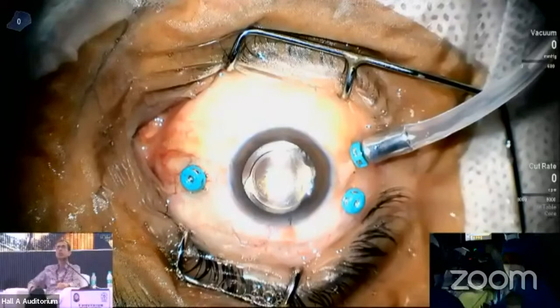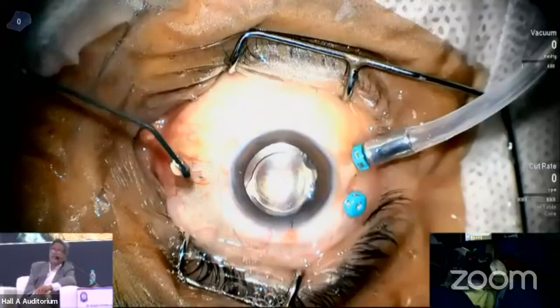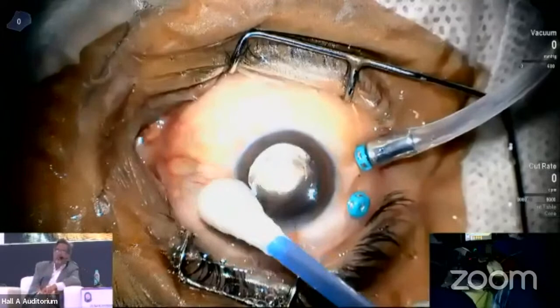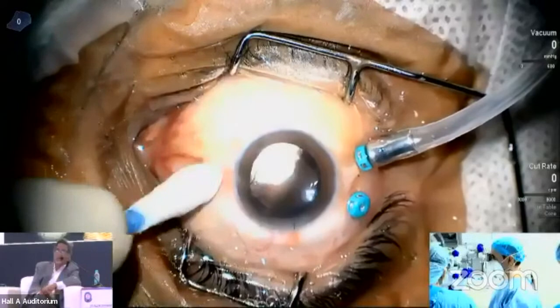Dr. Vinod is finishing, but we must tell there are various complications that can occur at the time of surgery also in vitreoretina. If the infusion cannula is blocked, then you can have hypotony, choroidal detachment. The beginner should understand all these things. They should see the 360 degrees while operating. That is one of the things which we have seen when people are operating. The infusion cannula should be open and flow should be regular.